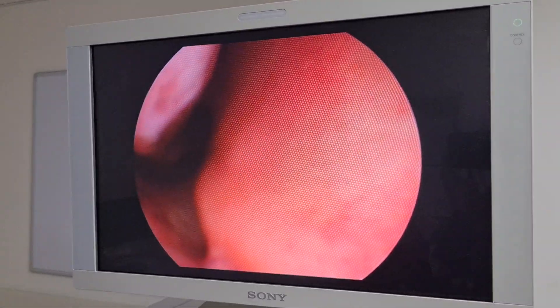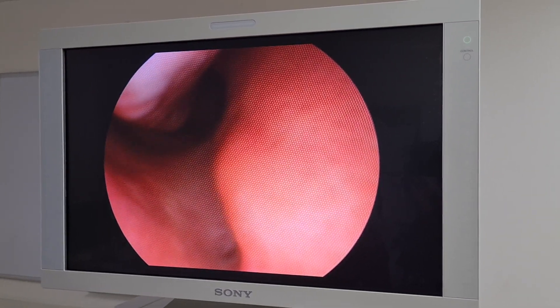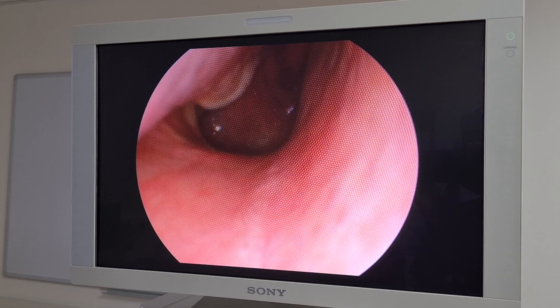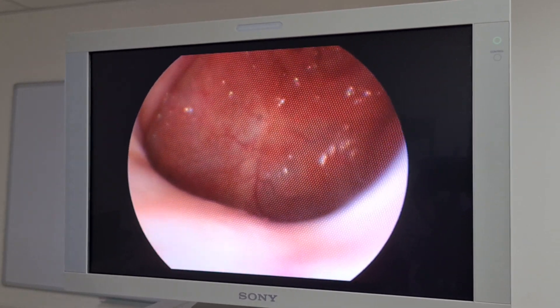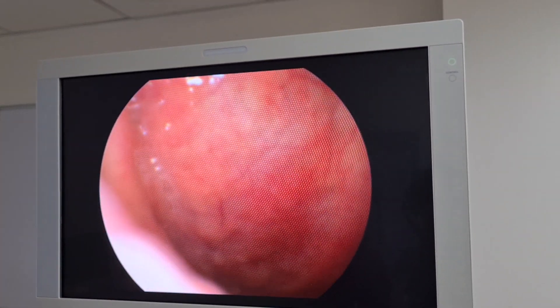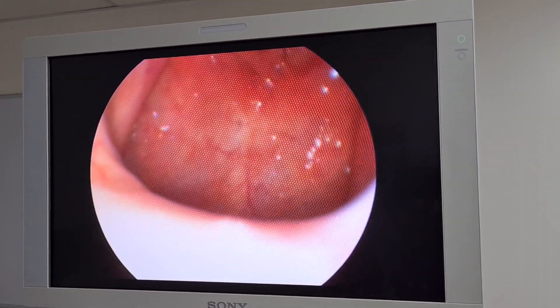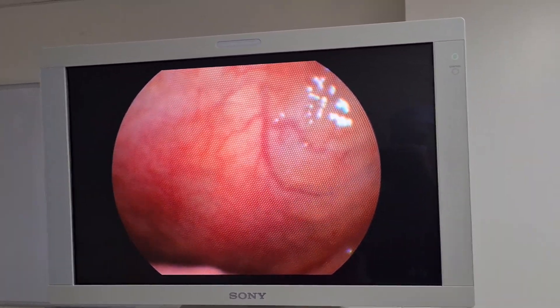I'm looking from the right side. At the top of the picture you've got the inferior turbinate, to the right of the picture is the septum, and on the left side you've got the lateral aspect of the nose. What I'm trying to do is go through this gap without touching any tissue, as it would be uncomfortable for Dr. Ringrose. I gently pass it through, sticking to the floor of the nose. I'm now rotating my camera without touching anything, taking a look at the Rosenmüller fossa — which is top left of the picture — and also the opening of the Eustachian tube on the right side. Now I'm going to start to gently look down.